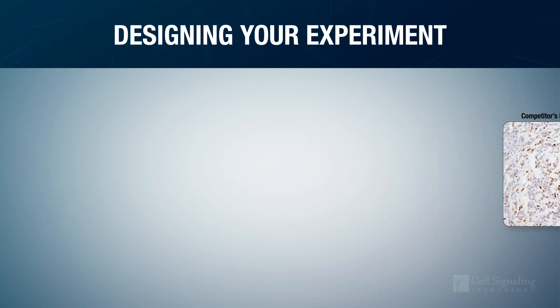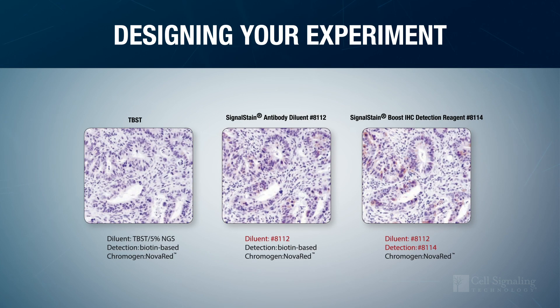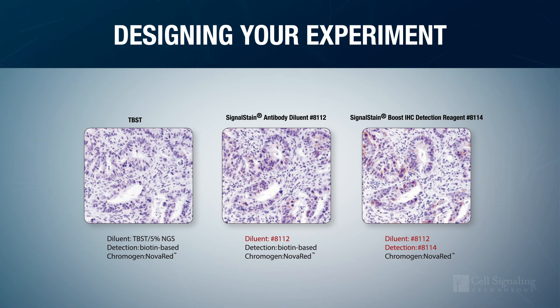Originally, we tested PLK1-Rabitmab with VectorNovaRed as our chromogen, which produces a bright red precipitate. However, as NovaRed did not provide a sufficient signal, we switched to the more intense dark brown DAB.